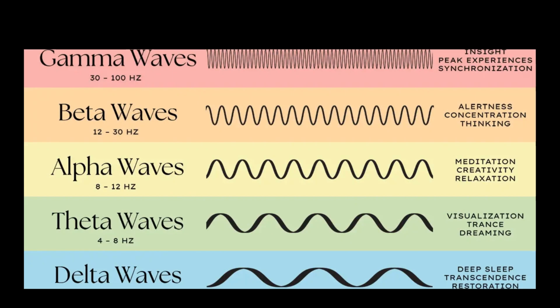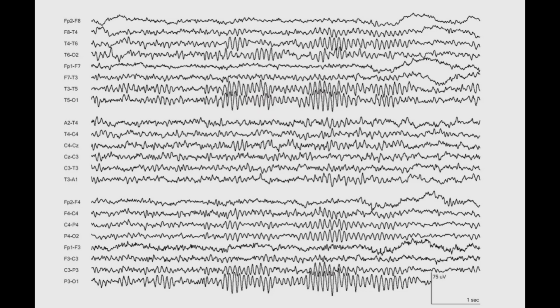And this helps us to find the alpha waves and all the other different brain rhythms. Precisely. And it allows us to compare EEGs across different people and different studies. That makes sense. So we're all on the same page. So alpha waves, those are the ones that everyone always talks about. The famous ones, right? Those are the relaxing ones. Yes, they're associated with a relaxed, wakeful state. And you'll see them most prominently at the back of the head, the occipital region.